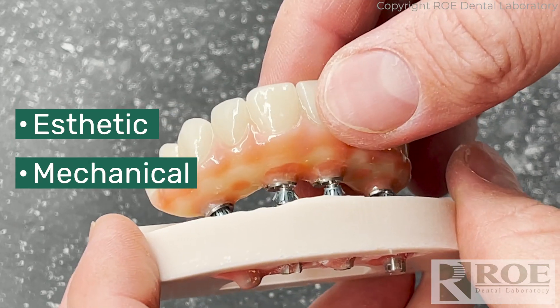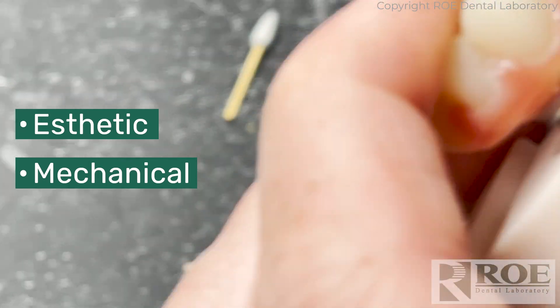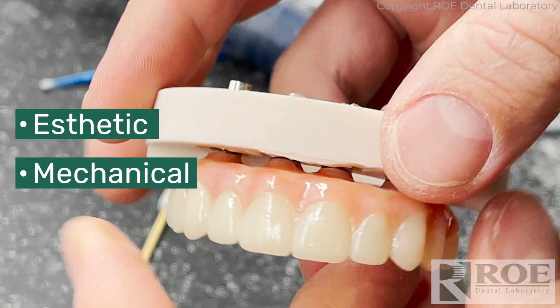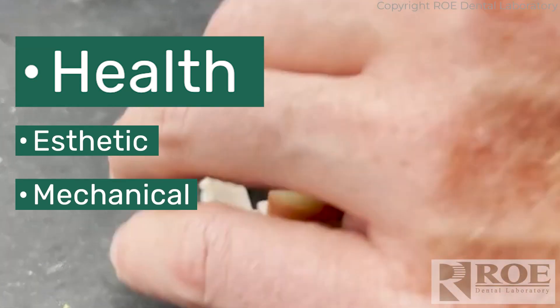These restorations, because they are solid without any kind of holes in them, allow them to be stronger in the patient's mouth, have less chance of failure down the road, both in the immediate load and the final restoration. But first and foremost, the benefits are the hygienic benefits and the health benefits to the patient.